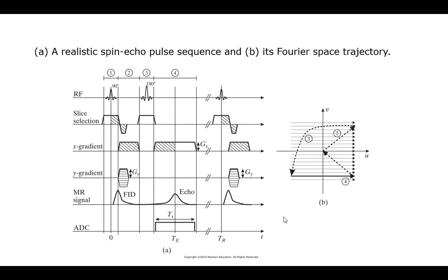And now I'm getting ready for my echo. So I want to read the echo out. So I have to apply my Larmor frequency perturbation in the X direction. And I read out. All right, so this encodes your X dimension. This reads it out. I get all the signals. I can now get all the frequency components, which is spatially correlated now. And then I need to clear this out, right? And they don't actually on this one show a decay, right? They do give you these. What are these?